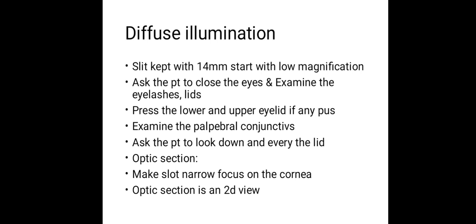In diffuse illumination we will be keeping 14 mm with a low magnification, and ask the patient to close the eyes, and we will be examining the eyelid and eyelashes. What are the conditions we will be examining for? Trichiasis, distichiasis, meibomian gland, punctum, chalazion and so on.